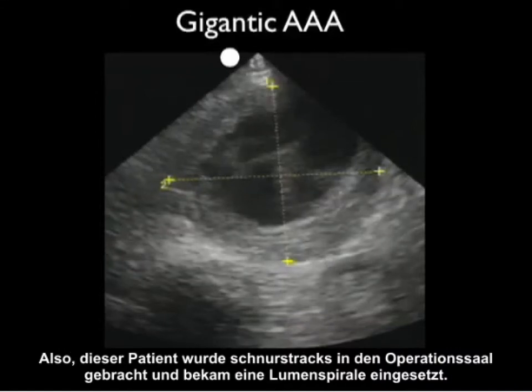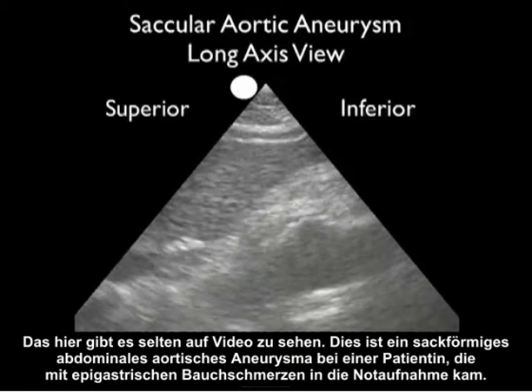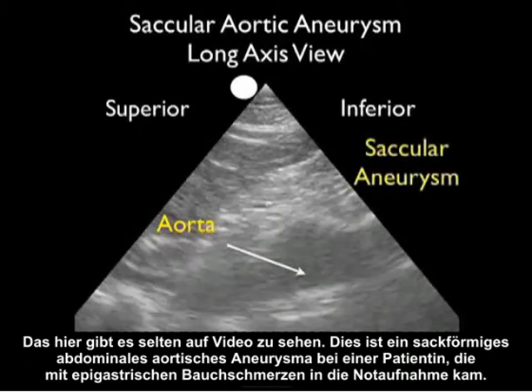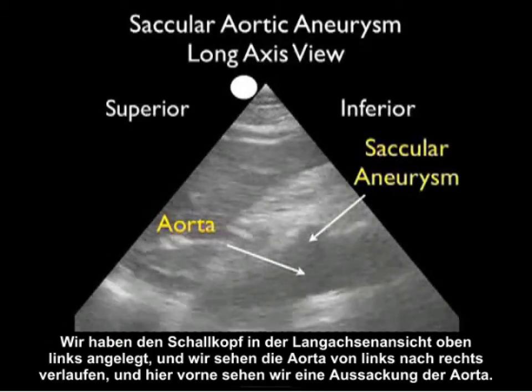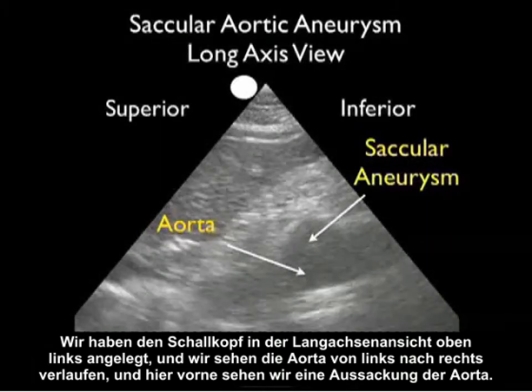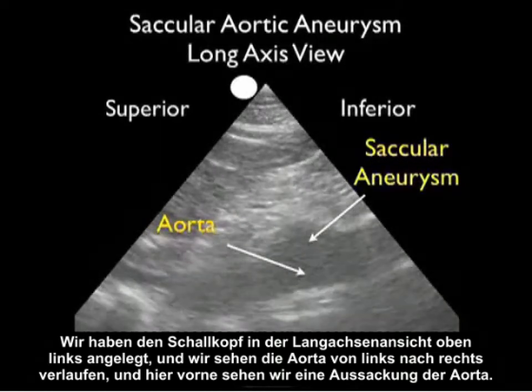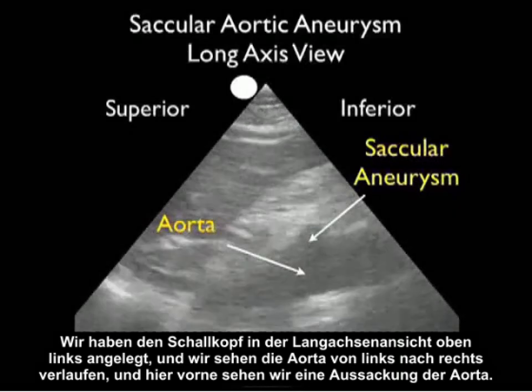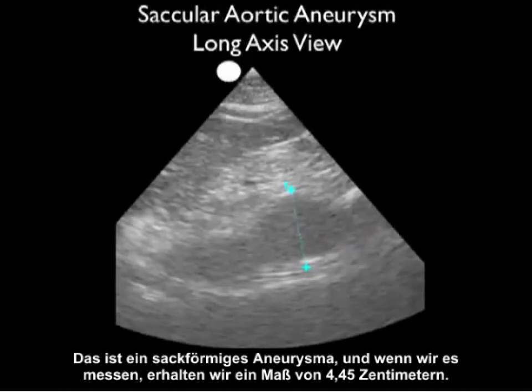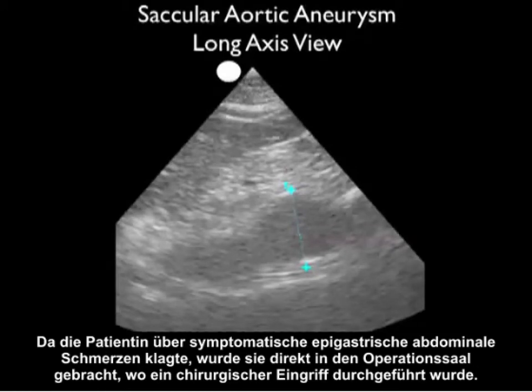This is a rare video clip showing a saccular abdominal aortic aneurysm in a patient who presented to the ED with epigastric abdominal pain. We have the probe positioned in a long axis configuration superior to the left, and we see the aorta running from left to right with an outpouching coming anteriorly — that's the saccular aneurysm. As we measure it, we come up with 4.45 centimeters. As the patient was symptomatic with epigastric abdominal pain over this aneurysm, she went directly to the operating room for operative repair.